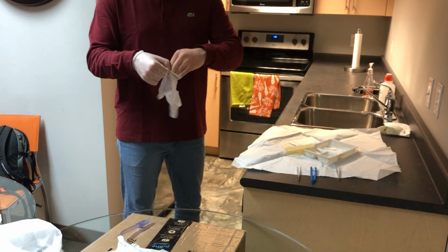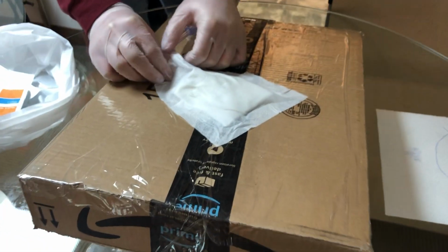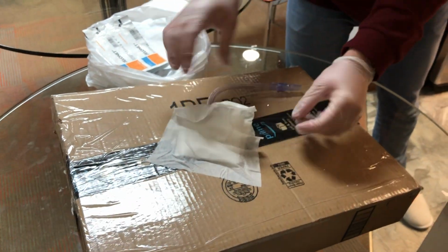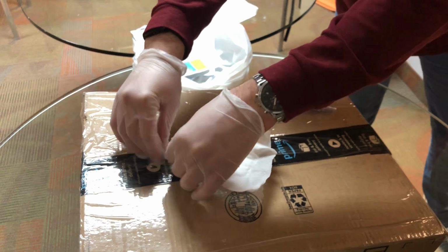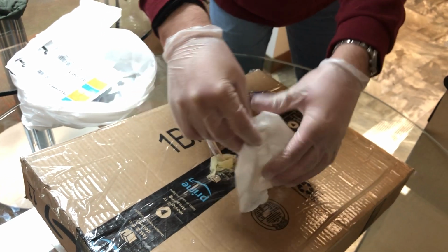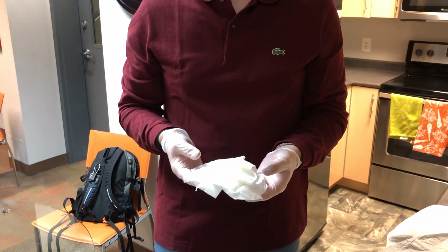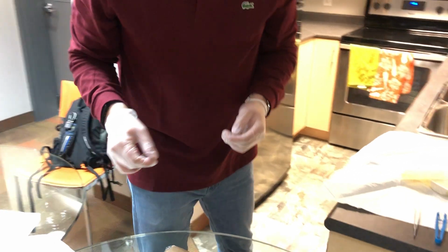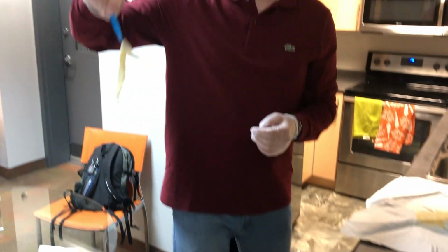Just need to put on some clean gloves. Start at the edge of the dressing, making sure to keep the tubing stabilized. It is sutured in, but we want to make sure not to manipulate the tube any more than we need to. Okay, perfect. And we can inspect the dressing to make sure that there's no drainage, no purulent drainage at all. So that's good, the site is dry and intact. Okay, and then we can remove the Jelonet using our blue forceps. No drainage on that as well.